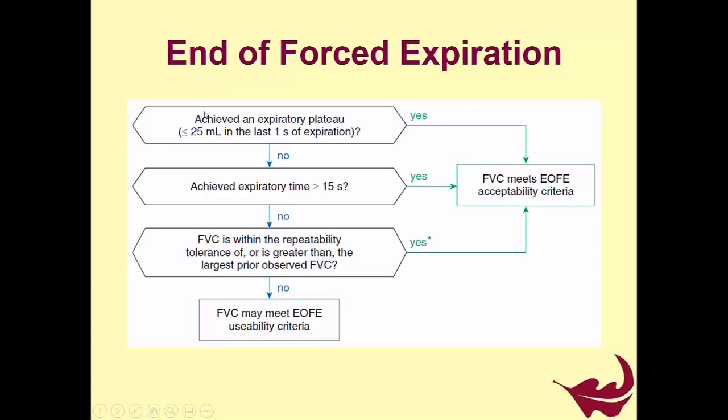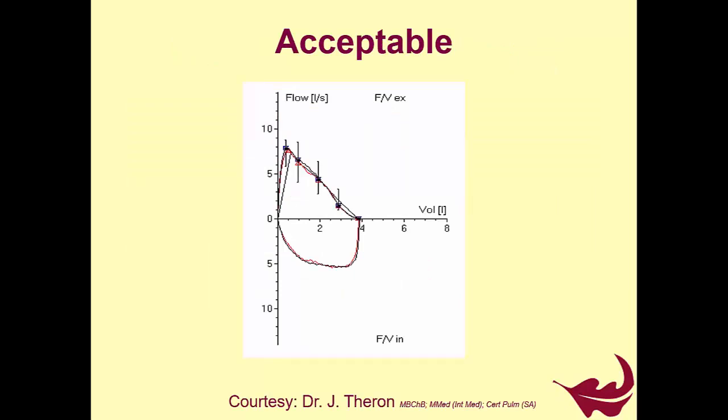And when I show you the graphs, what I typically refer to is I say that this is like the plane comes into land. That's how I would describe it. So if that happens, then of course you meet the end of forced expiration criteria. Otherwise, 15 seconds, as you can see there. And if you can't do those, so there's no plateau and you can't do 15 seconds, then we look at the repeatability. And sometimes you will see that in children and so on, so not applicable really to the diving environment. But sometimes people with restrictive diseases, they can only exhale for a very short period, and that may affect them. So this would be an acceptable test.